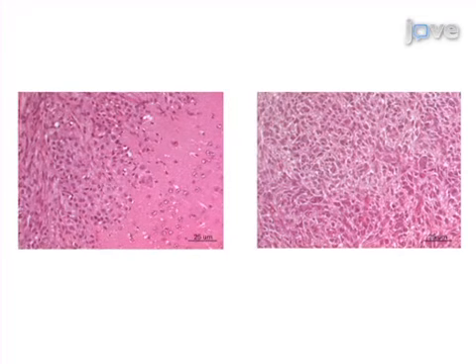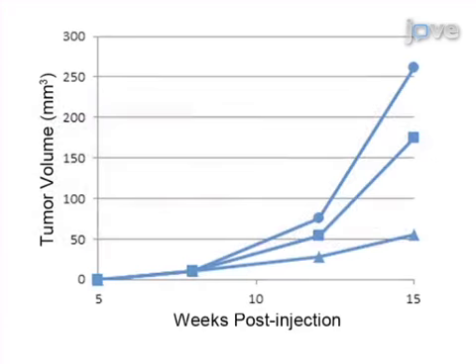Ultimately, a consistent mouse model with tumor growth histopathologically similar to the human condition can be developed, and growth rates can be measured by luciferase-based in vivo imaging. The precision of this technique is vital to understanding new therapeutic strategies for human brain tumors.